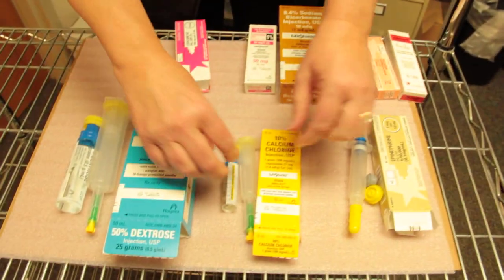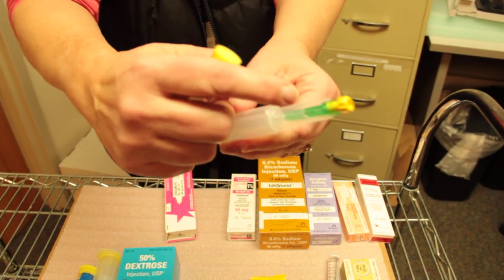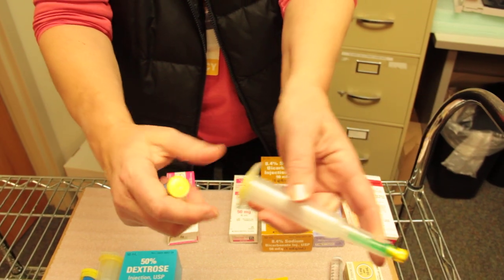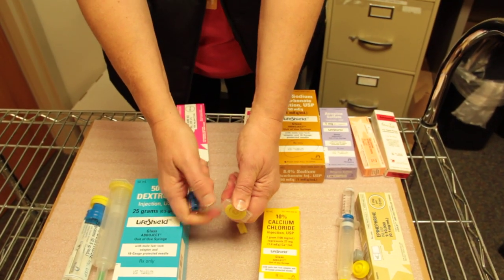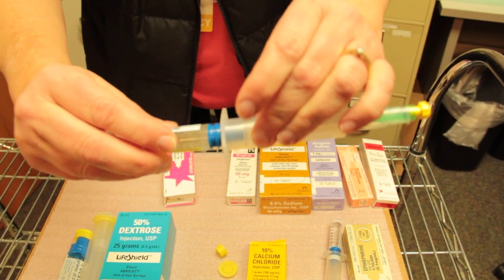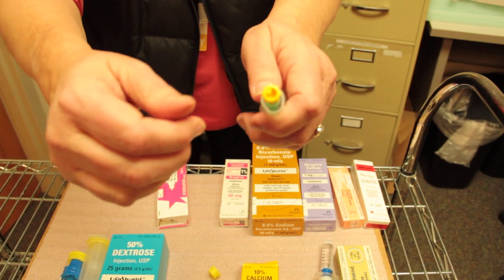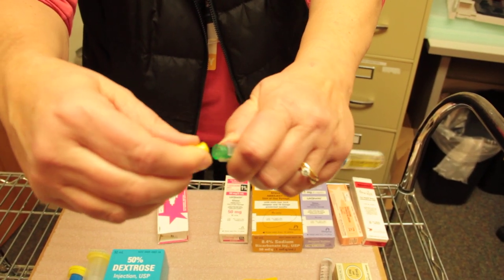The other type of syringe has a needle already attached in that green section. There's really no need to use that. We'll still assemble them the same way — just flip the yellow pieces off, gently screw them together, and in this case all you need to do to get the luer lock is to twist off the little yellow cap, and then you have your luer lock site.